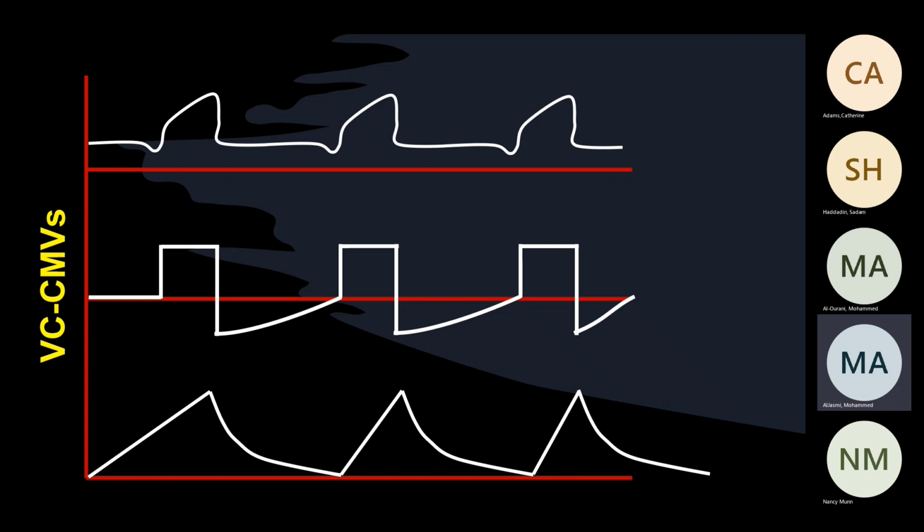Why is that? First of all, these are all triggered, is that right? Yes, but the flow is still the same, square-shaped flow, and there are no changes in the timing itself. So all of these breaths are mandatory breaths. If I see one where the shape of the flow itself changed, it was decelerating, that's when I say maybe this has intermittent breaths. This is the one that has been done by the patient.